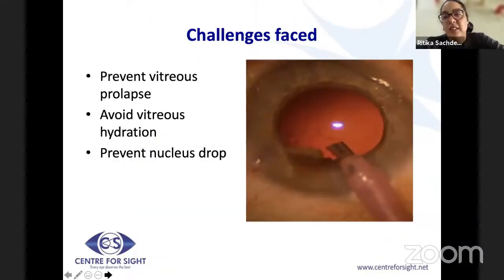the most common complication and one most of us have encountered and we would want to deal with well is a posterior capsular rent. We know that once we have a PCR, we see a bright red reflex, and AC may deepen, the nucleus followability goes away, vitreous surfaces and may clog your phacoprobe.